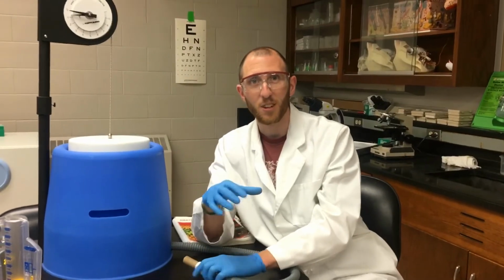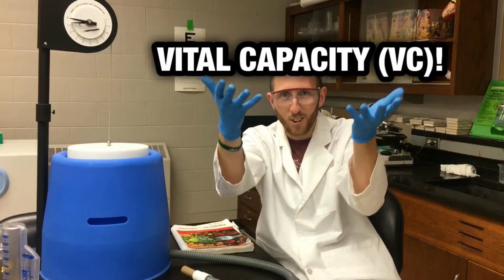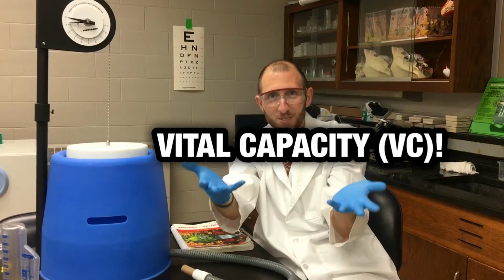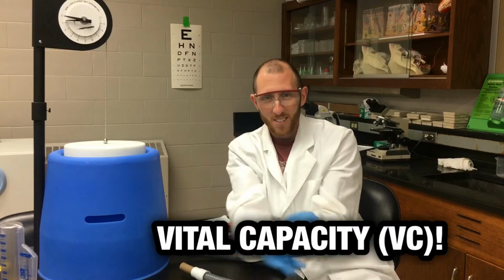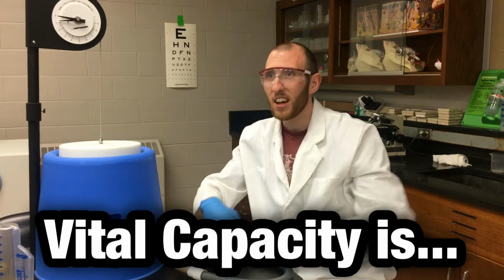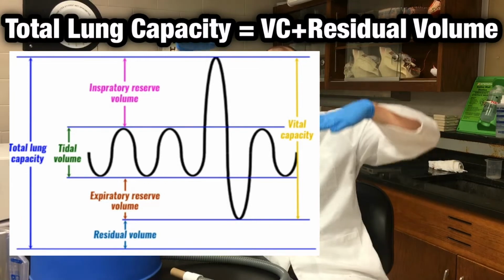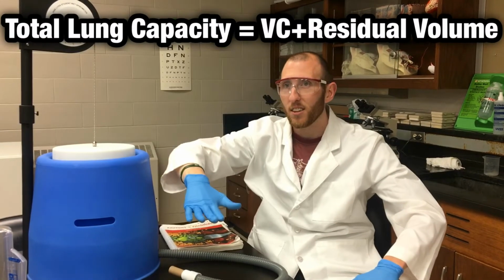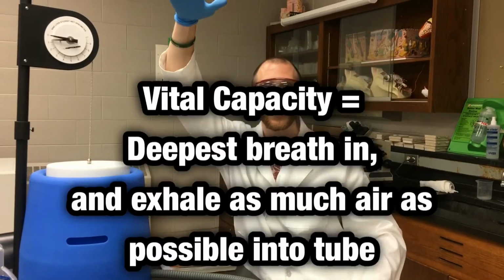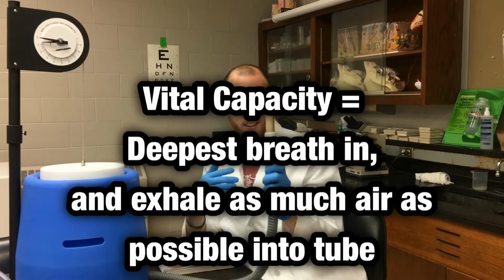The other one we want to measure is as much as you can inspire maximally and as much as you can expire maximally. So it's the deepest breath you can breathe in and as much air as you can breathe out into this tube.